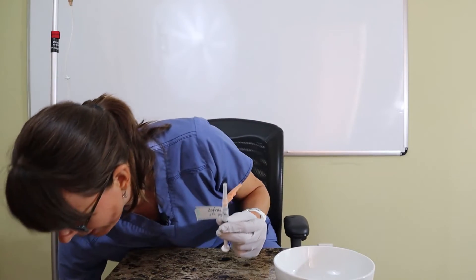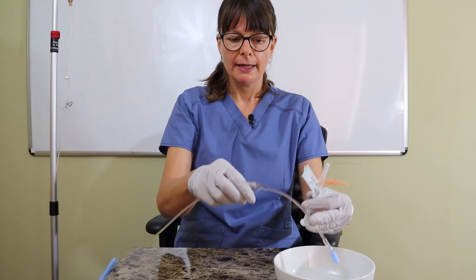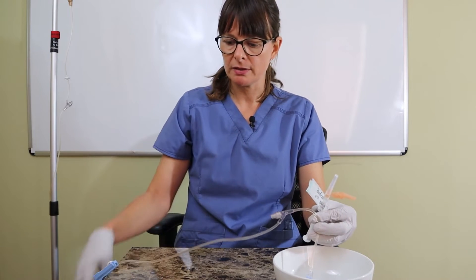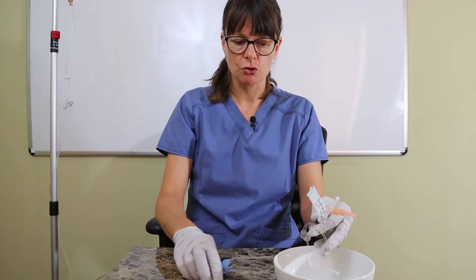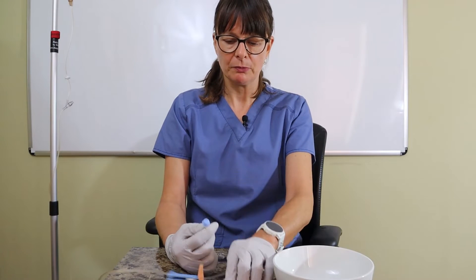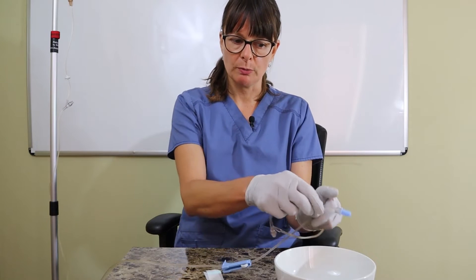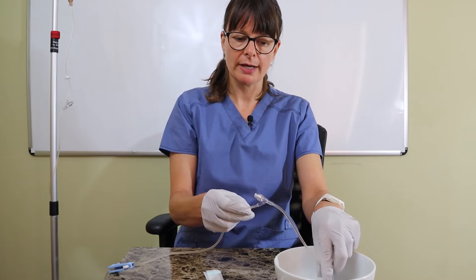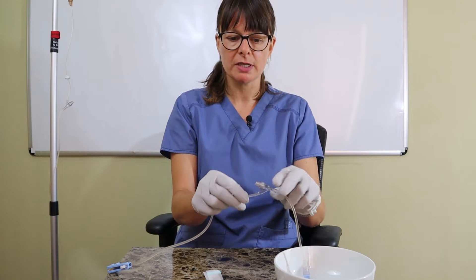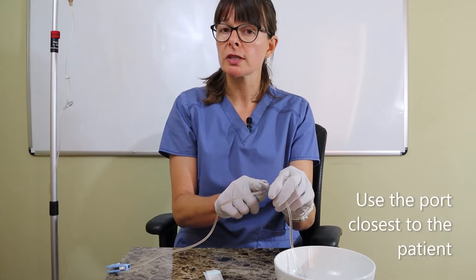Because I don't have an actual IV here, I put my IV tubing in the bowl so that I'm not dripping any medication over it. We'll say for demonstration purposes that this port is hooked up to the patient. When I select the port I want to administer the medication, I always want to use the port that's closest to the patient.